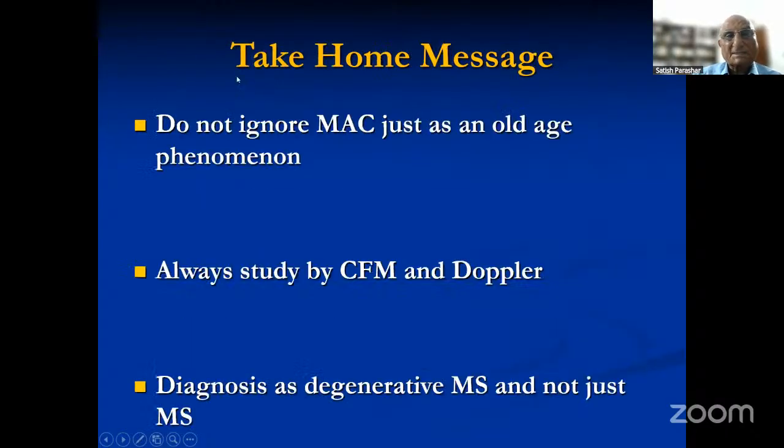So the take-home message is, do not ignore mitral annular calcification just as an old age phenomenon. Always interrogate it by CFM and Doppler and diagnose it as degenerative mitral stenosis, as it is usually known.